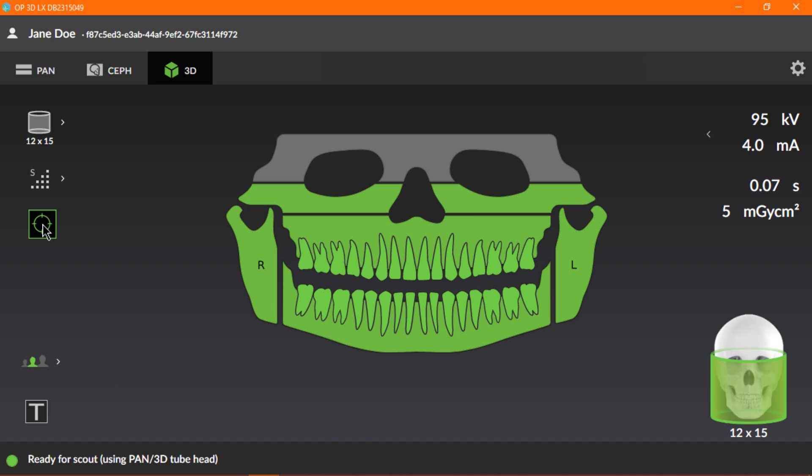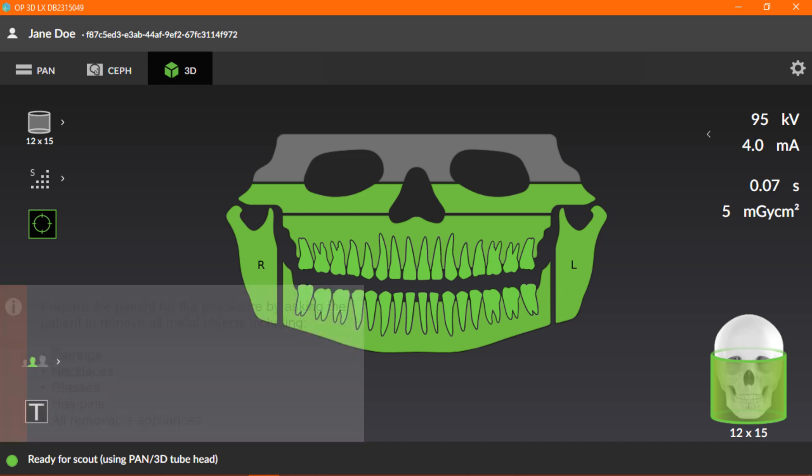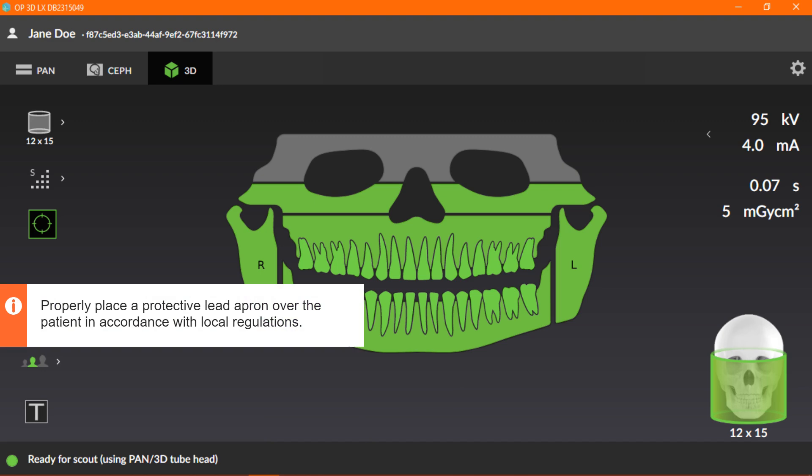When the scout image program is active, the field of view coverage illustration turns green, and the status message bar device status indicator will indicate ready for scout. Prepare the patient for the procedure by asking the patient to remove all metal objects, including earrings, necklaces, glasses, hair pins, and all removable appliances from above their shoulders.